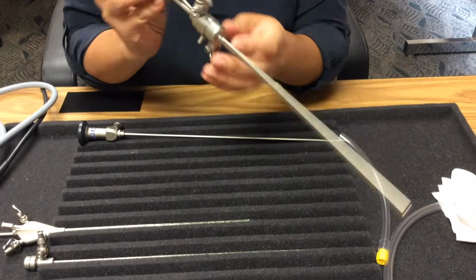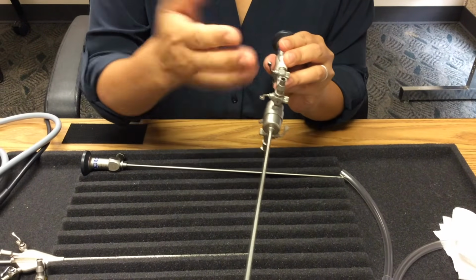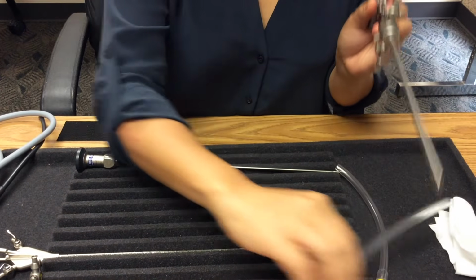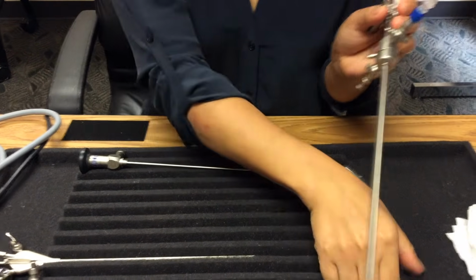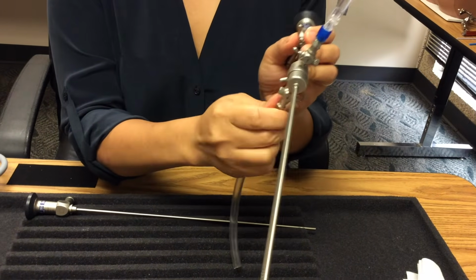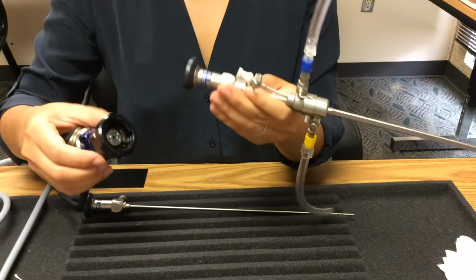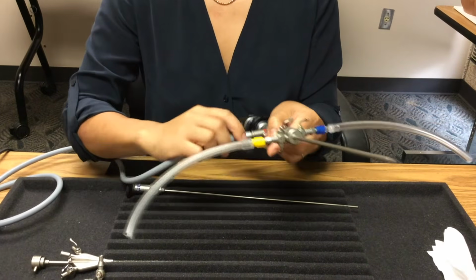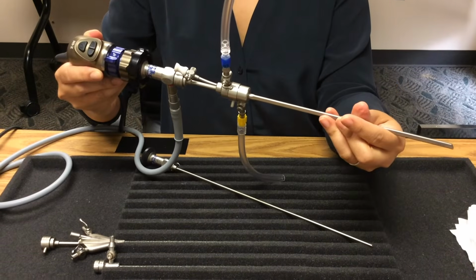You will now connect your inflow and outflow tubing. The inflow tubing connects here, closer to your body. The outflow tubing is further. Your inflow tubing will be blue like water. Your outflow tubing will be yellow. Now attach your camera, followed by your light source. This is a fully assembled hysteroscope.